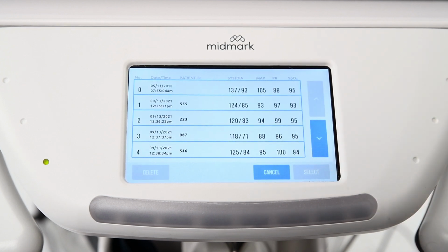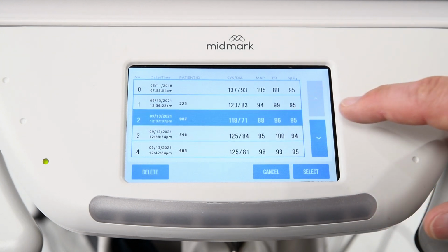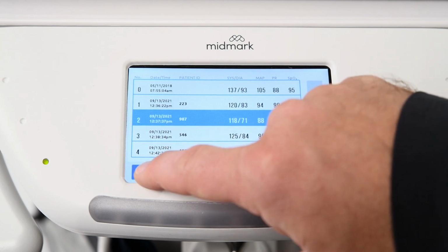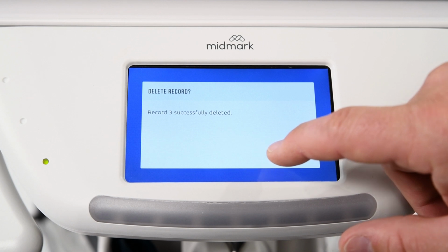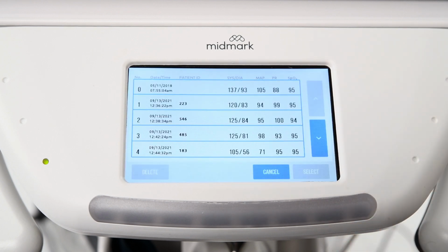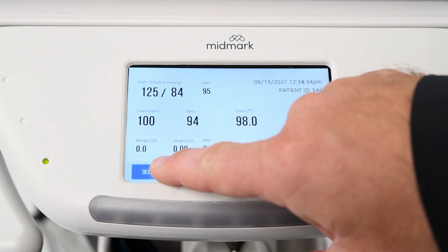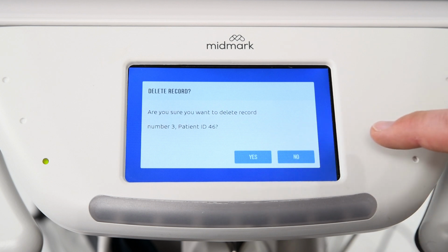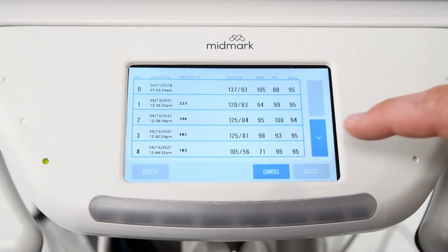To delete data for a single record, touch the patient record in the patient record list to highlight it. Select the Delete button, then select Yes or No on the confirmation screen to delete the selected patient record. Or you may choose to view a record in the Record Detail screen, and then delete it by pressing the Delete button. After pressing Delete, a confirmation screen will appear. Press Yes or No.